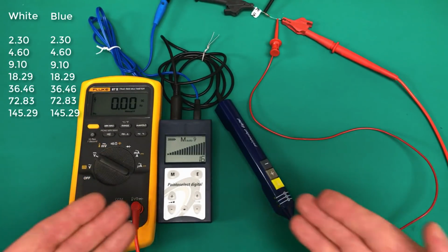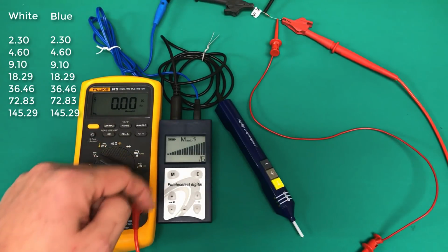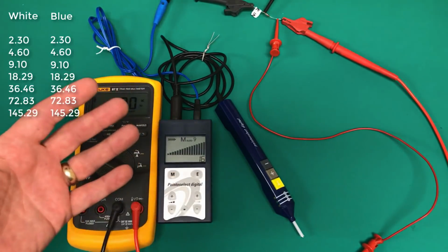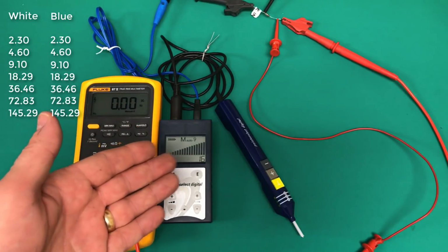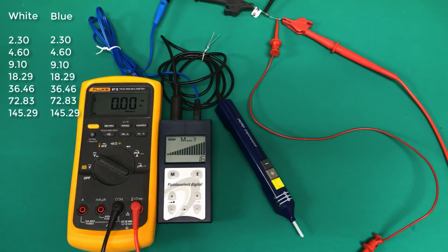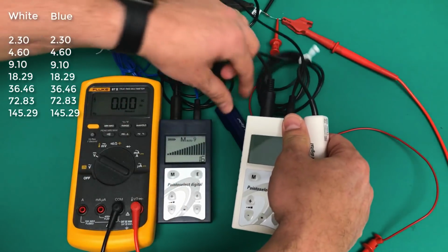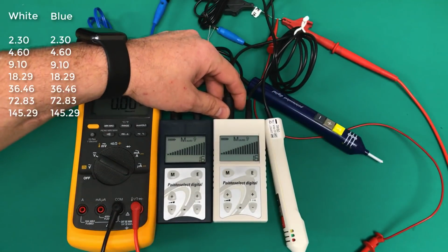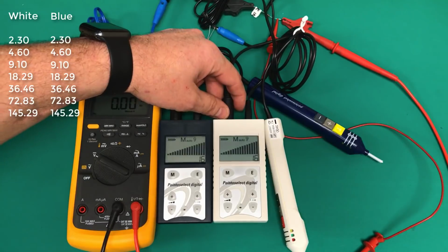You would not be able to get down to the 100th of a hertz if there was any difference in the circuit design, the quality of the materials, the quality of the components. There's way too many variabilities that would introduce inaccuracy into that circuit if there was any difference at all. And the fact is, there's not any difference at all. The only difference is the color of the case. When you look at these two units, they are exactly, precisely the same.